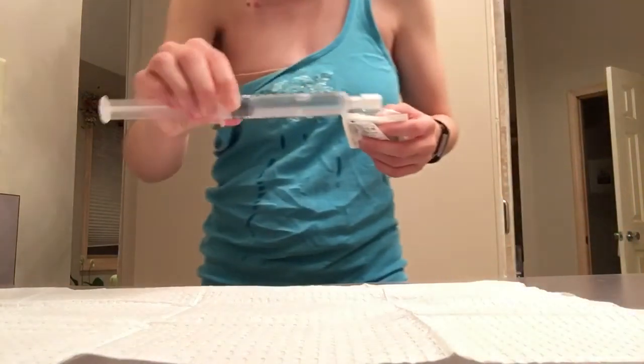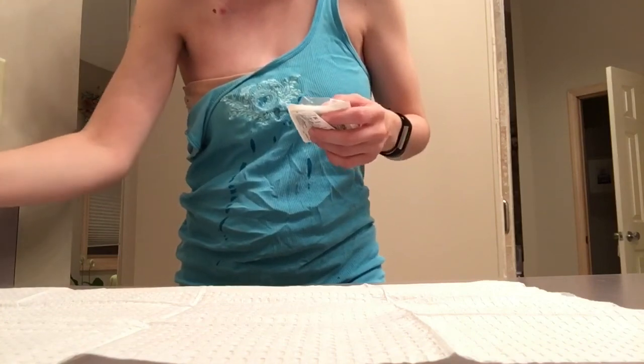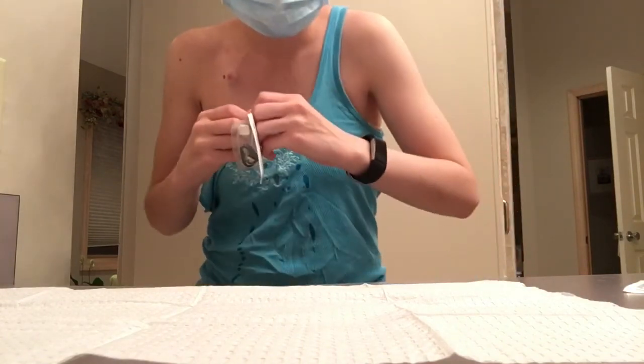Putting my saline, not on a sterile field because it's not sterile saline. The saline itself is sterile, but the packaging is not, which is the same thing for these. This is weird because you can't see my face, but I either have to kneel down or have it up. There's no in between.